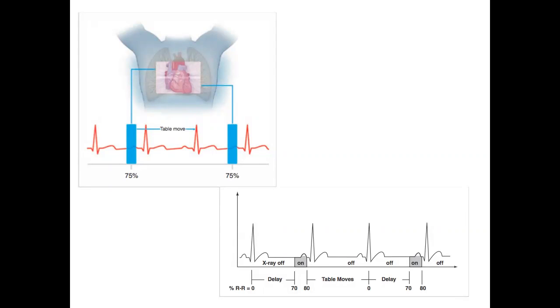Yeah. It's all under one bolus, I'm assuming, but given an older scanner, would we have to re-bolus for each injection? No, you still have enough contrast, but you see, as you stitch them together, you see the contrast density is different between the different 3 or 4 slabs that have been stitched together. Yeah, but it's still pretty quick, so there's enough contrast. Yeah. That's why sometimes you have to do the different bolus because of the contrast.